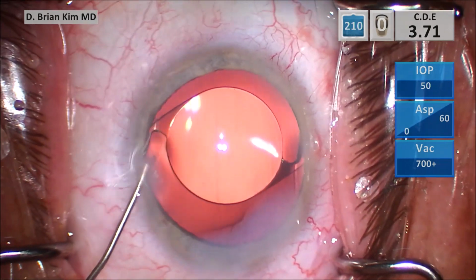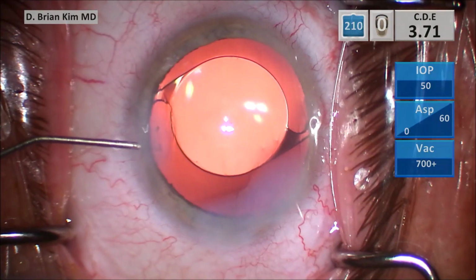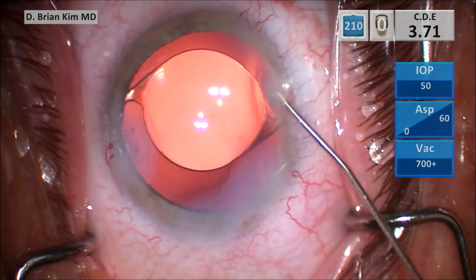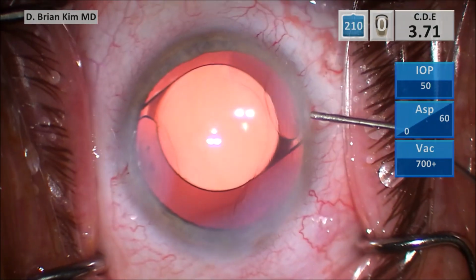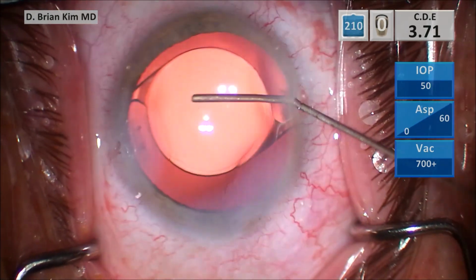And so by using it as a chopper, you can position that phaco tip deep in the bag, so you're not approaching the lens from the surface, which is utterly inefficient. You're able to go deep and sandwich the lens more effectively, crushing it in half. And that's why you can see how I'm able to easily and confidently fracture the lens pieces using mechanical forces, even though you might think, how do you do that? It's impossible to fracture the lens that way.